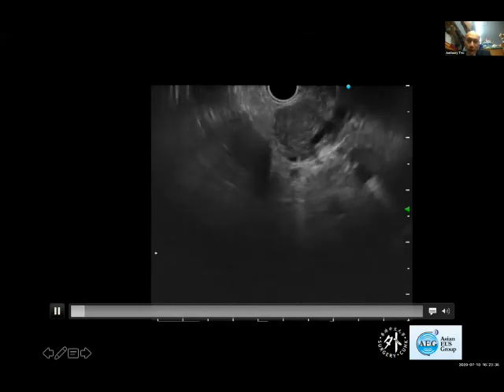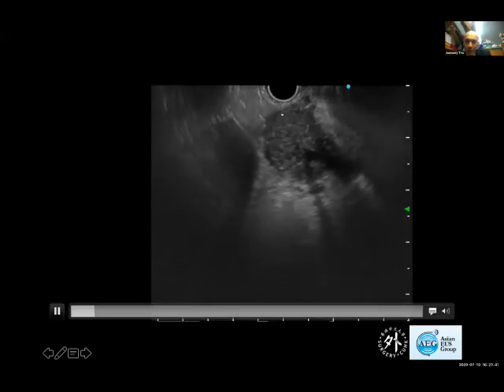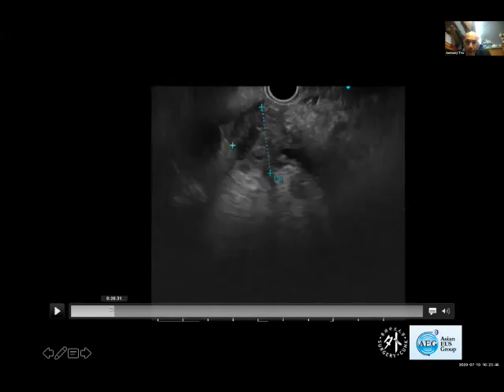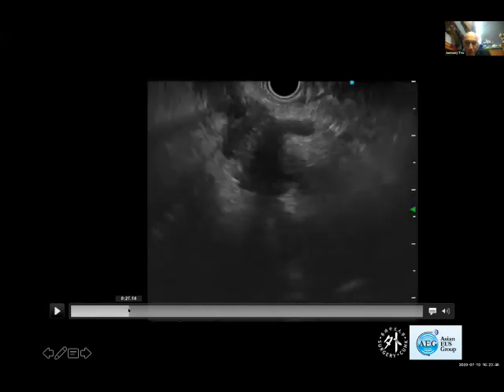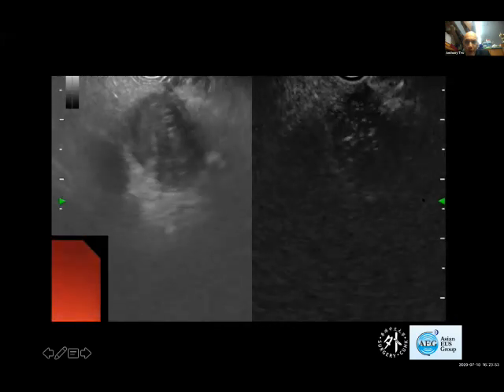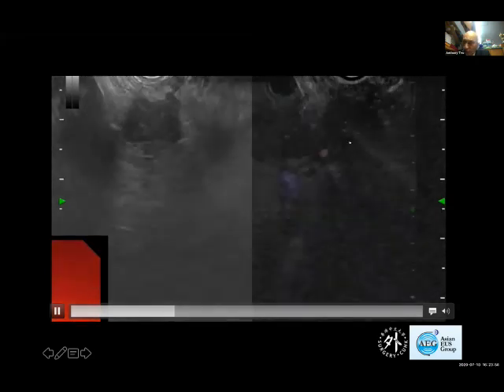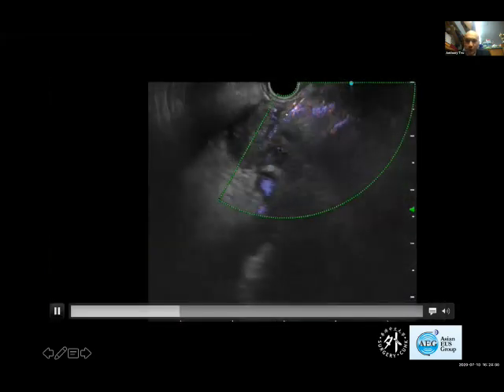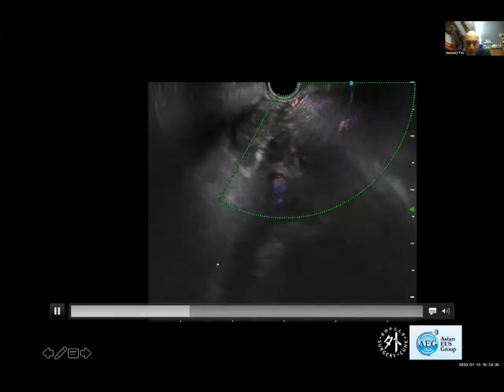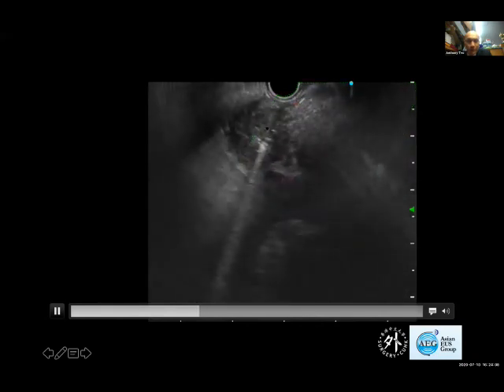This is a patient with unresectable pancreatic cancer. We have a protocol to evaluate the efficacy of radiofrequency ablation. This is a tumor. The needle will come in from here. This is a pre-procedural contrast imaging. We want to see the viability of the tissues in the tumor, and then the needle will be inserted. There is a needle. And during radiofrequency ablation, you will see some bubbles coming up right there.